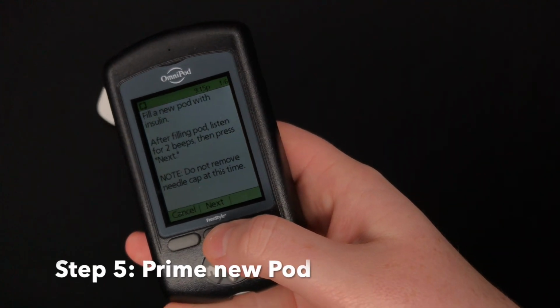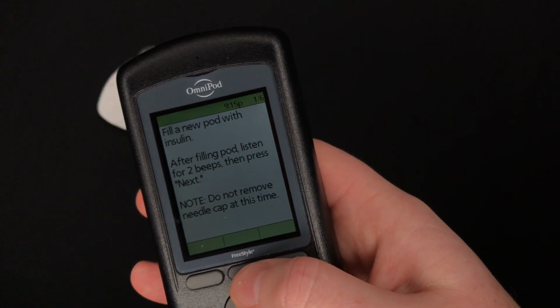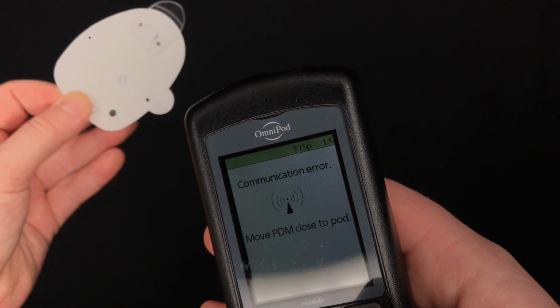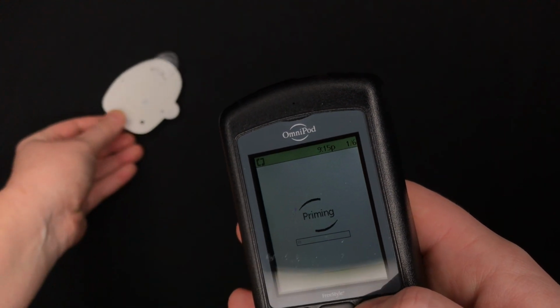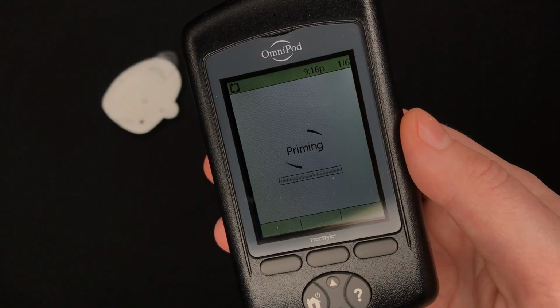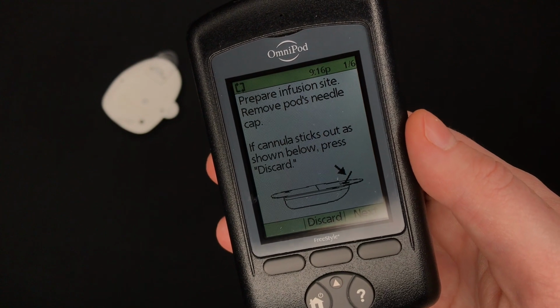After filling the pod with insulin and hearing the 2 beeps, you're going to press next on your PDM. If your PDM is too far away from your pod, it might beep at you. No biggie, I get beeped at all the time. Just move it a little closer to the PDM so that way they can communicate. During this step, your PDM is going to prime your pod so that way you are ready for needle insertion.